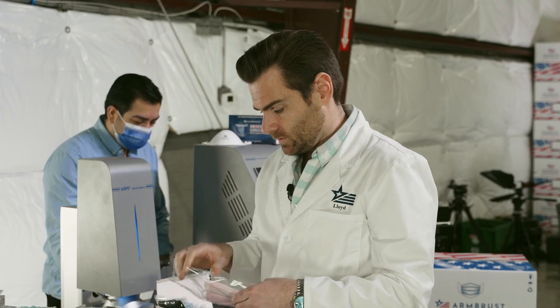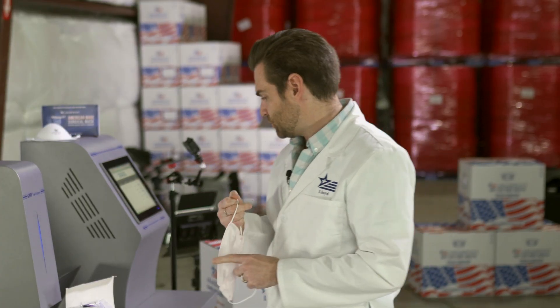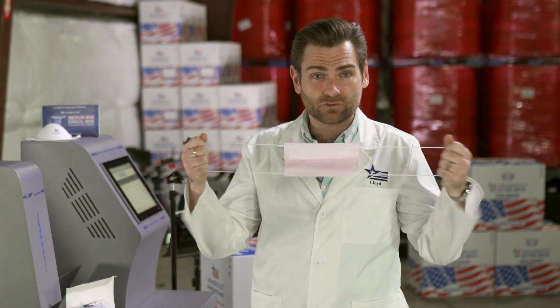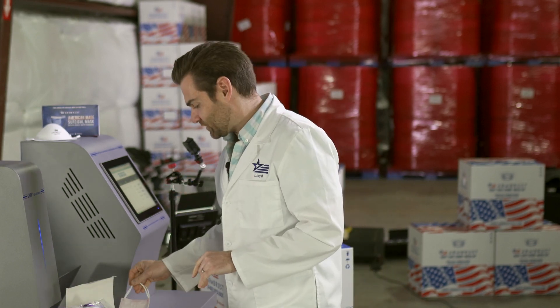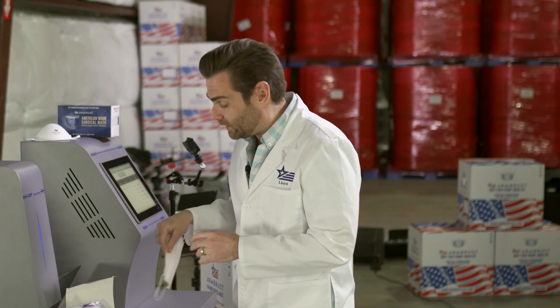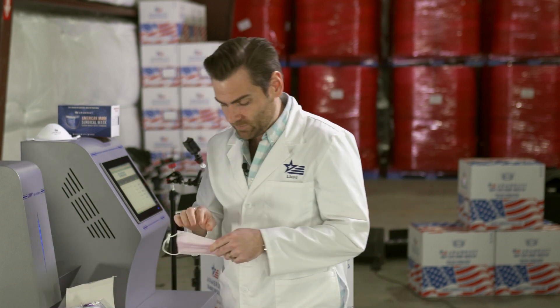It's pretty good construction, but the ear loop broke. Let's try another one — ear loop broke again. That's the thing I don't like about a lot of Chinese masks. I'm going to try two at once and see if it breaks. Assuming I can get one that doesn't break when I put it on my face, let's try this thing on.